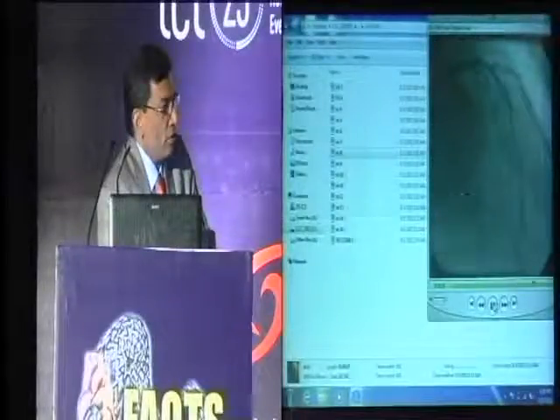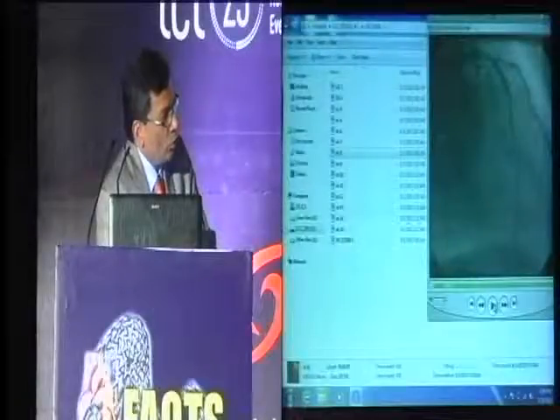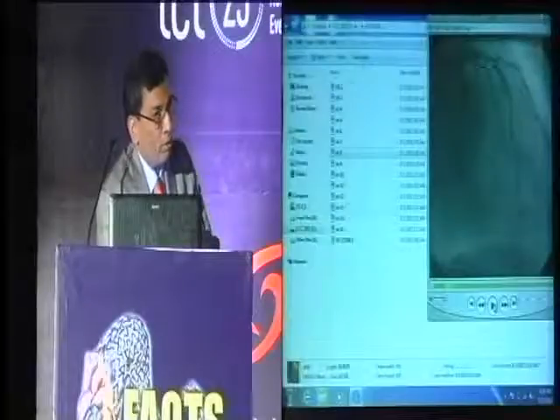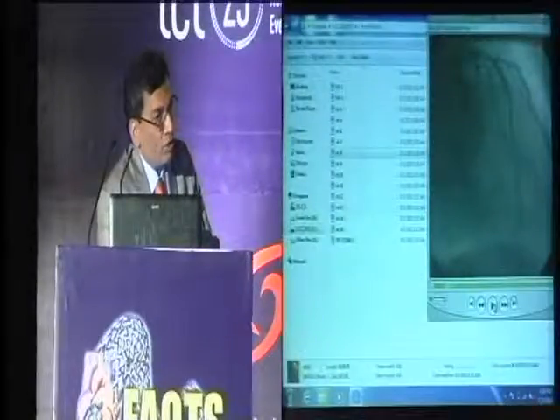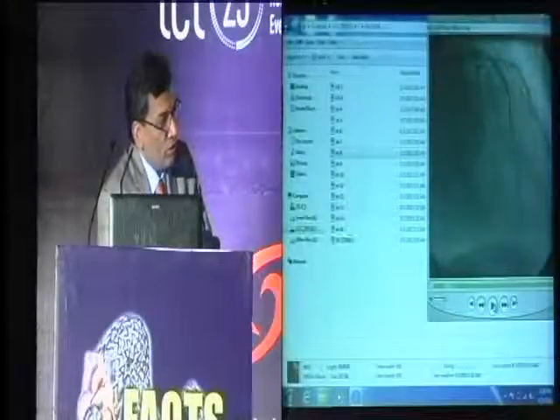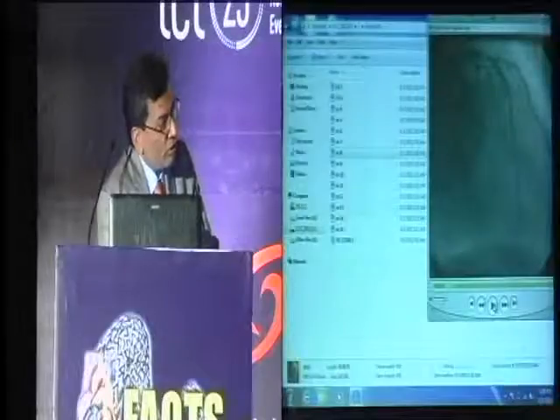As you can see, once the vessels opened up, the more unstable of both is the diagonal. The diagonal branch is as big or equally important as the LAD. The LAD flow is now brisk and the underlying lesion is not clearly unstable.